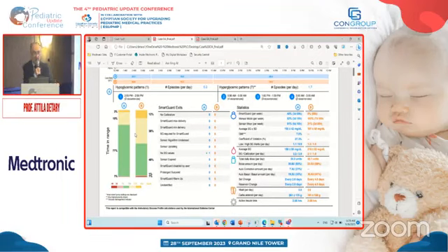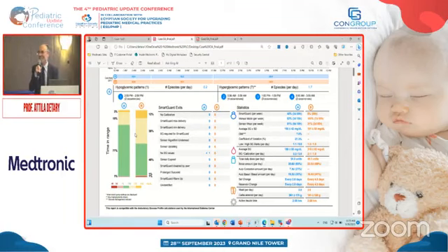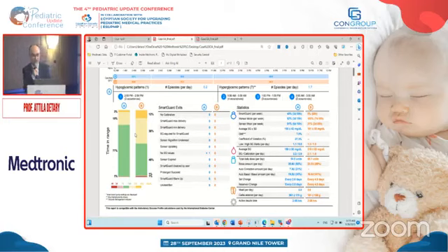So if you have a look at the time in range, you see that in the reference period, when the patient used the pump in the manual mode and only 30% of the time on the sensor, the time in range was 48%, which is rather poor. So if you translate it to hemoglobin A1C, it's around 8-9. So not very good control. But to be honest, it's close to what you can expect in the manual mode with CGM. So if you do not automize the pump, you can achieve about 60%. As soon as you automize, the outcome is much better.